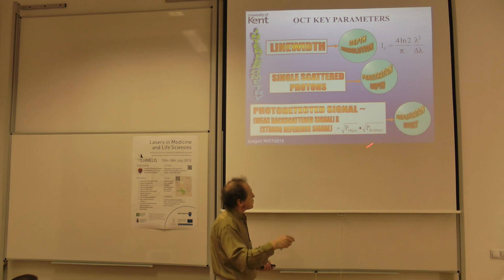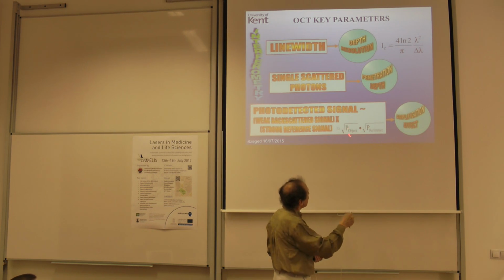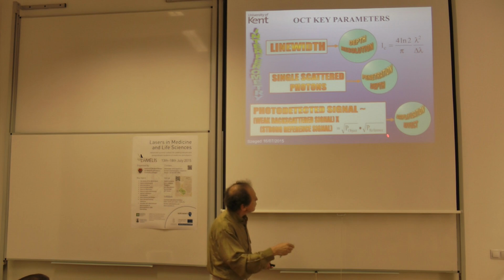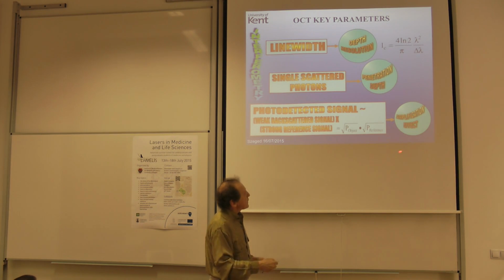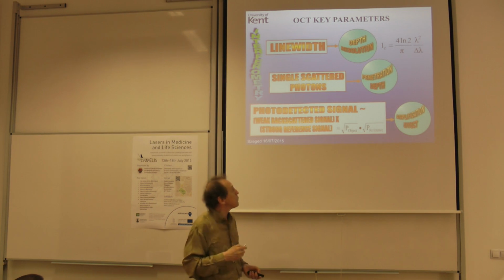You achieve a little bit more because you apply the third parameter, i.e., according to the interference equation, the interference signal is proportional to the amplitude of the signal reflected and the amplitude from the local beam. But the local beam is very powerful, so it's like you have an amplification effect. That gives us better penetration than the confocal microscope built at the same wavelength with the same system. So these are the three main key parameters, and I still haven't started OCT. This is a low coherence interferometer, and these are the parameters of a low coherence interferometer.